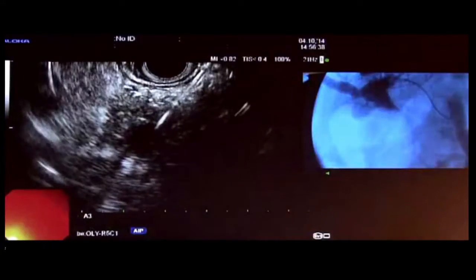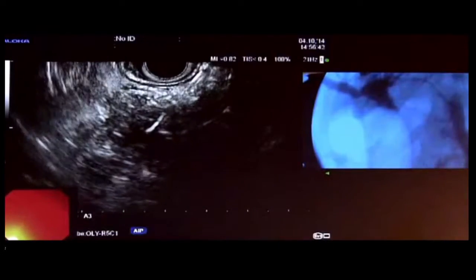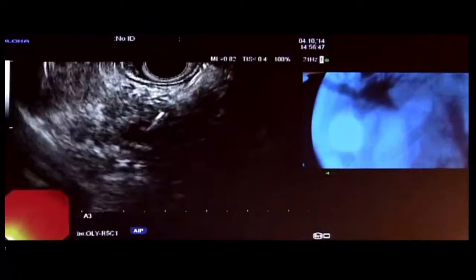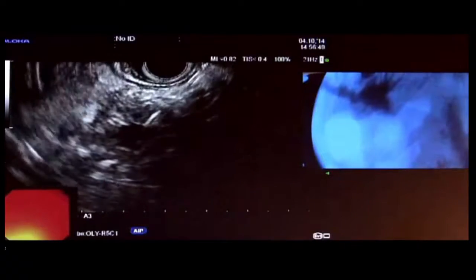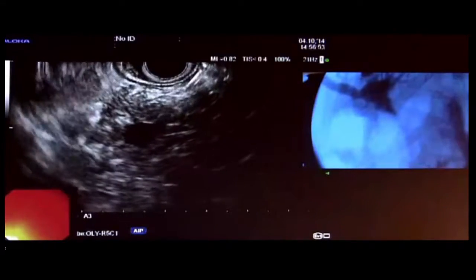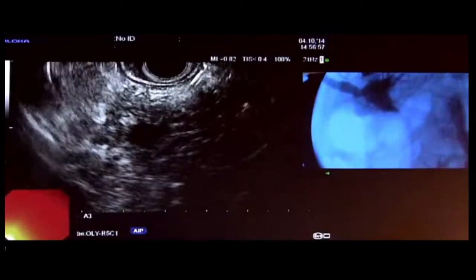So you never try to cross the papilla with a loop in the wire. It won't go, not when it's buckling back the way it did. But yes, you can try to knuckle it forward. Go ahead, forward. Yes, and yes, you're across. I think we're across. All right, I think so.